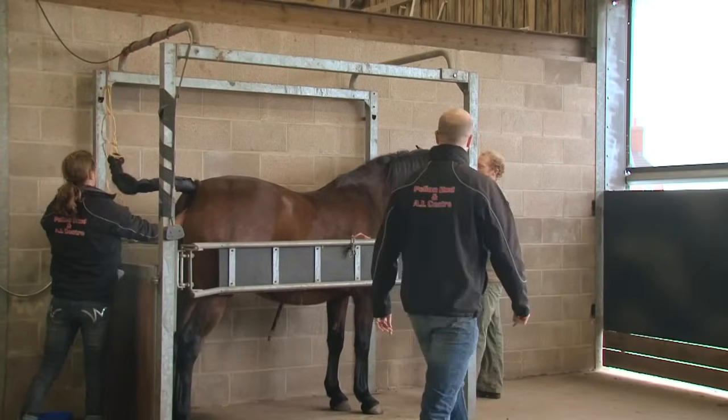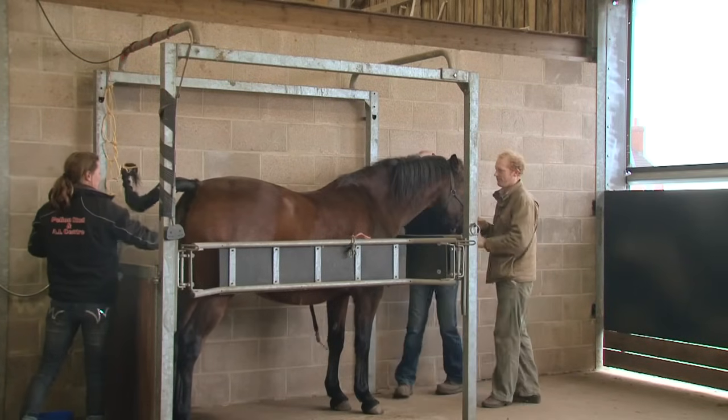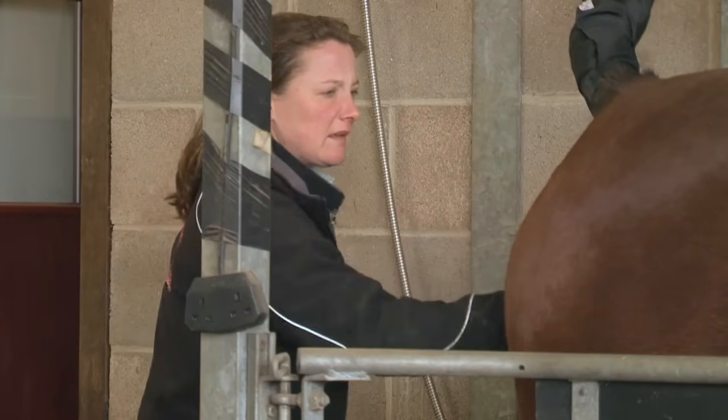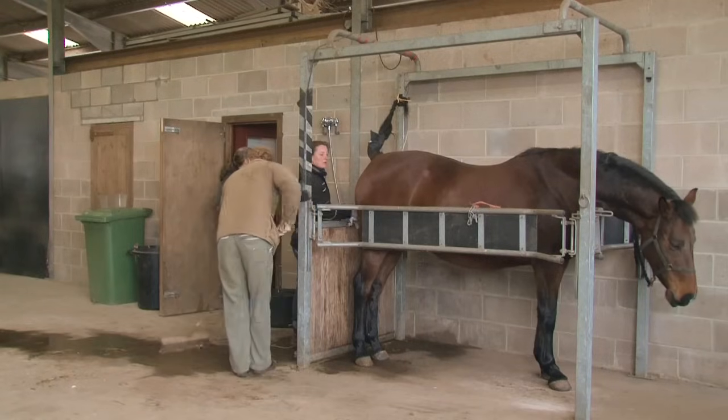The mare has walked into AI stocks. Her tail is wrapped and tied to keep it out of the way. The perineal region is washed gently with copious amounts of warm water using a clean hand, dirty hand technique. The area is then dried.